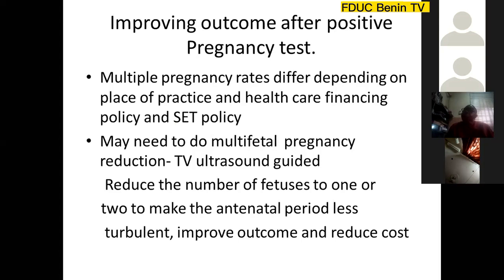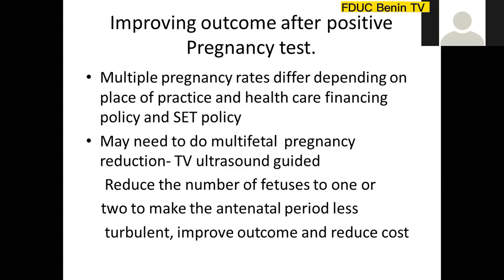Now, what do you do with the ultrasound? You do a vaginal scan, just like you do when you are doing your egg retrieval. You use your egg retrieval needle, locate the heart of the fetus, and puncture it 2, 3, or 4 times until it stops activity.